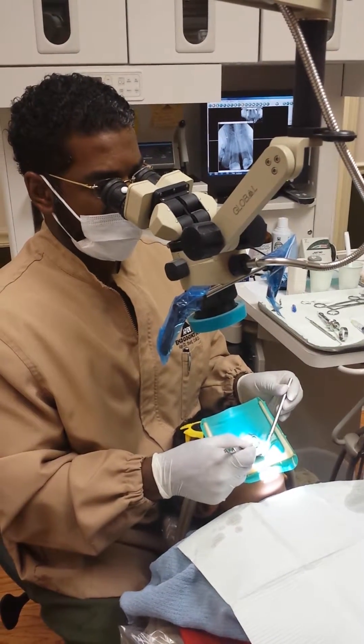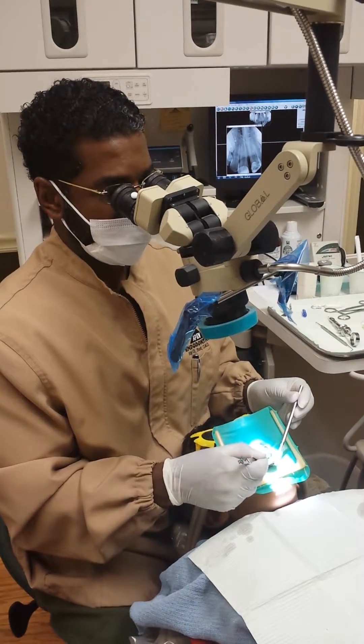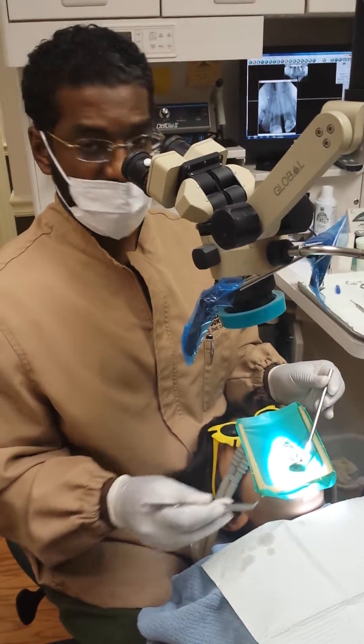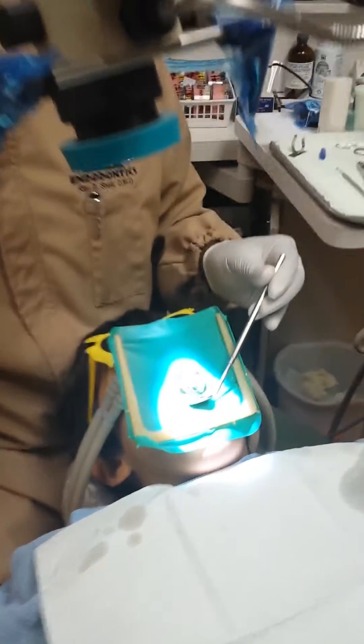Now I'm dry. I find a little pressure here, a little pressure to that. So now if the camera person can go and look in there now, it should be — you can see that it's pretty dry in there.